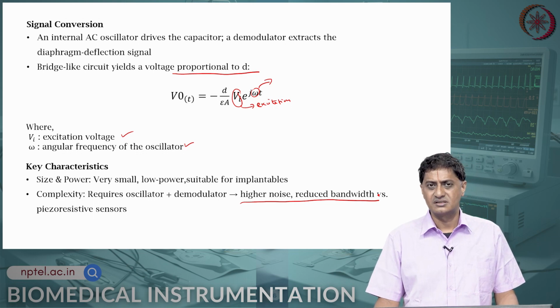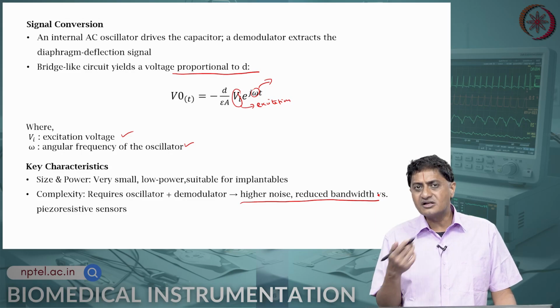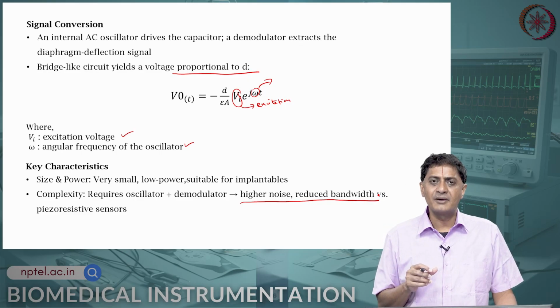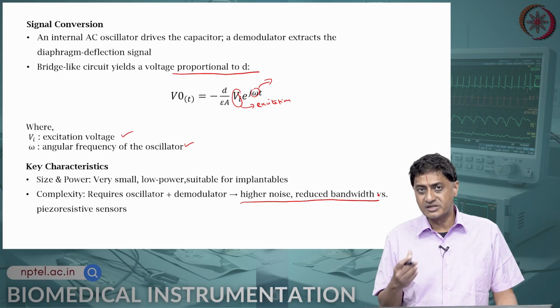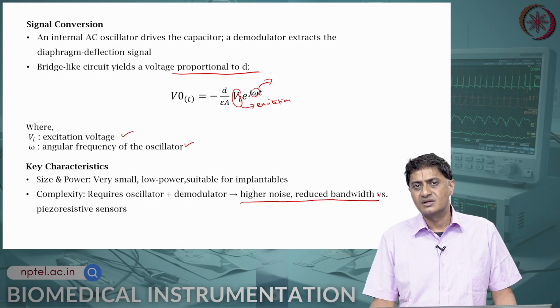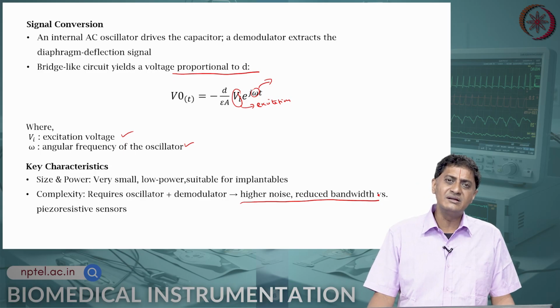The current work in this field involves the development of MEMS and NEMS based sensors and AI enabled interpretation, that is, having AI as part of the circuitry that will decide whether a pattern of pressure is anomalous or healthy, for example. AI enabled pressure pattern detection can be used as part of a feedback loop that enables early or preventive clinician interventions.